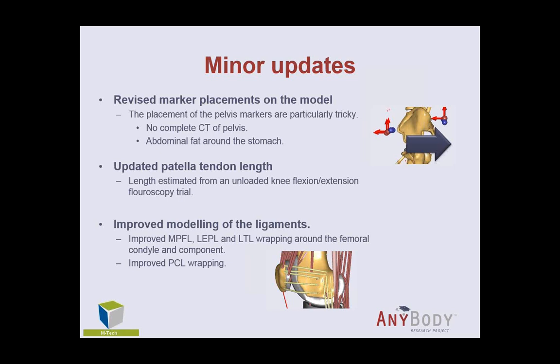We also did some other minor things, which I don't think are as important as the recruitment, as you'll see in a bit. But one thing we did was we went back and looked at whether we had placed the markers in the right place on the model. For the pelvis, it was particularly tricky because we didn't have a full CT. And also, if you look at this particular subject, he actually has quite a bit of abdominal fat. So the question is, where is the pelvic bone inside this when you see the markers?